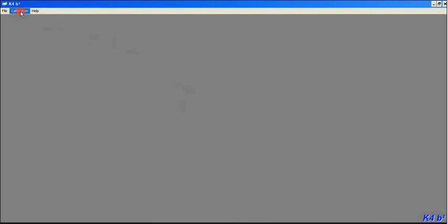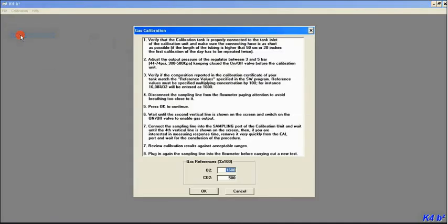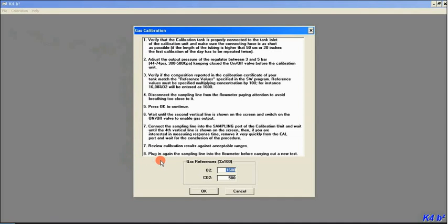Hey guys, here's the computer version of the calibration for the gas line. Go ahead and click calibration gas line. You'll see the gas calibration window pop up. Go ahead and read all that over, make sure everything's all good.